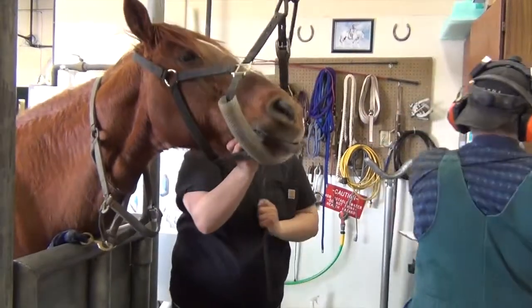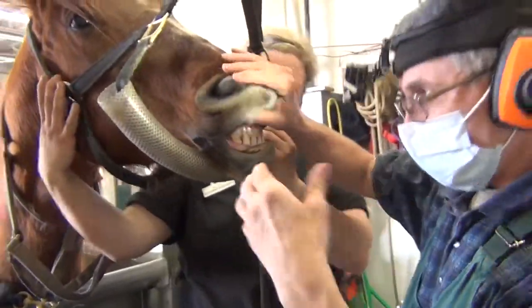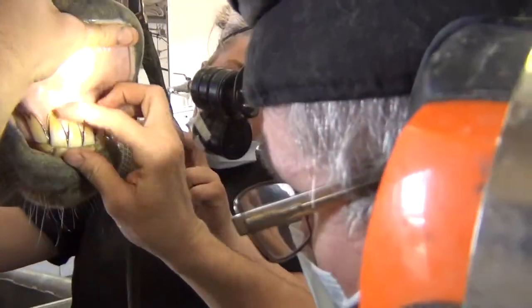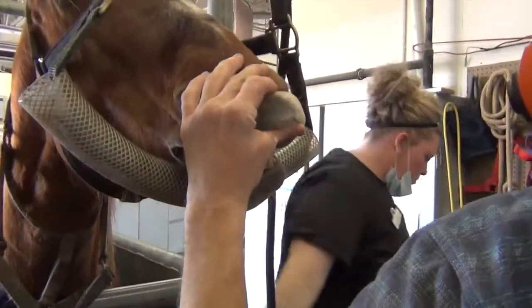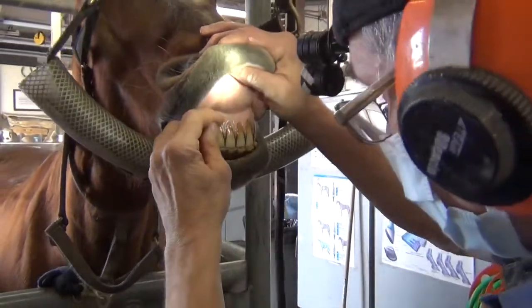Most of the time we don't have much to do with the incisor teeth. The biggest thing is if they're wearing unevenly. Again, we'll try to balance them. Sometimes they get tartar at the base of the tooth. We'll take advantage of having them sedated and scrape this off.